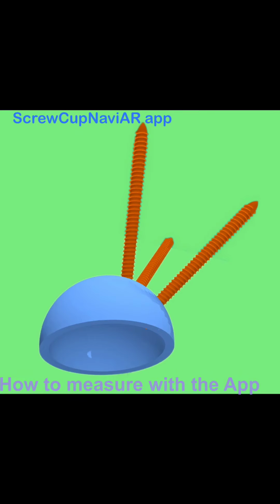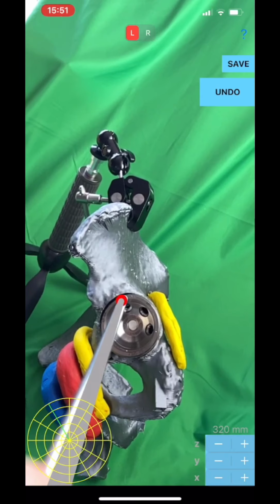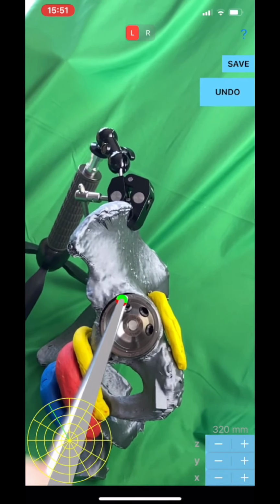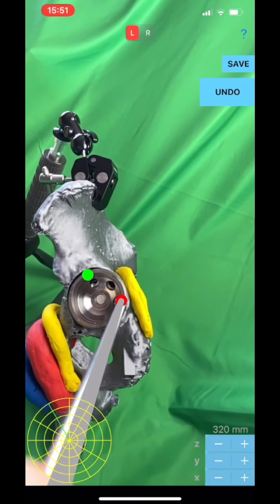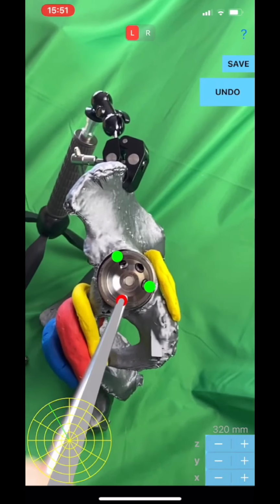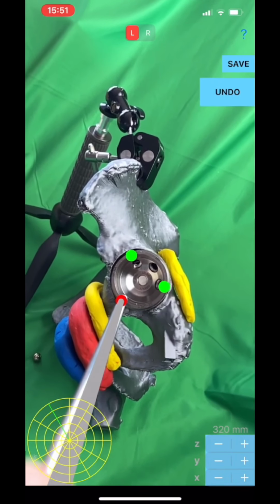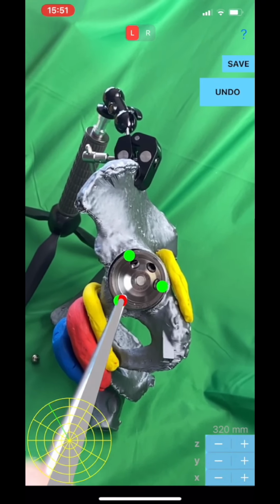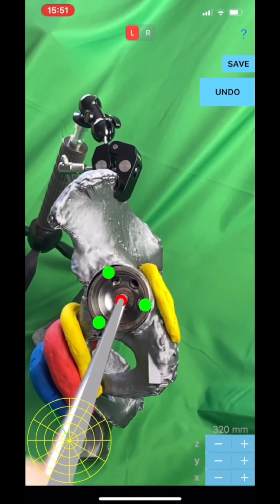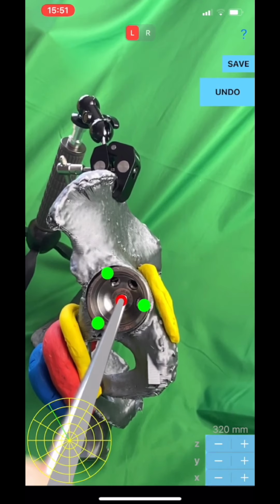Once the surgeon has finally approached the patient's bony acetabulum and has placed the cup, registration is performed with the pointer tip of the SIPT. Four points are required: three points at the marginal circumference of the bony acetabulum rim or cup, one in the anterior superior lip A1, one in the posterior superior lip A2, and one in the posterior inferior lip A3. The 4th point, in order to complete the cup registration, should be at the deepest part of the cup, A4.